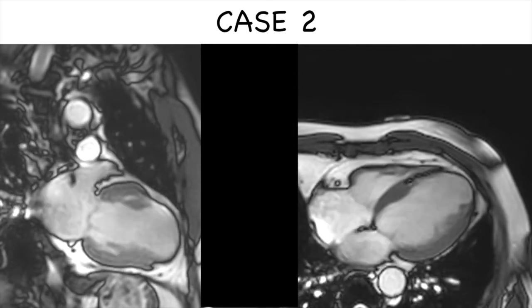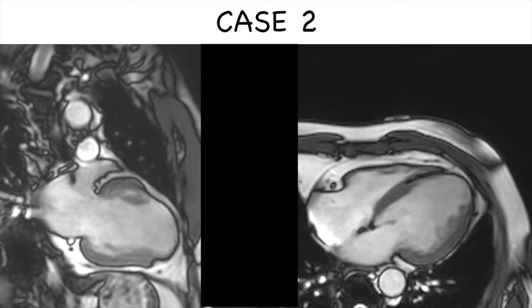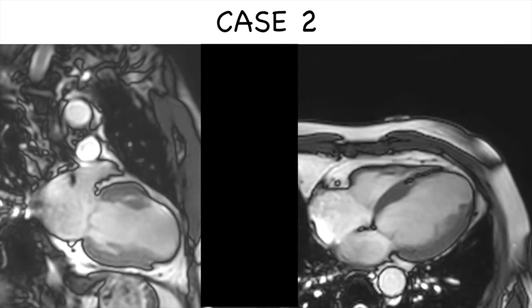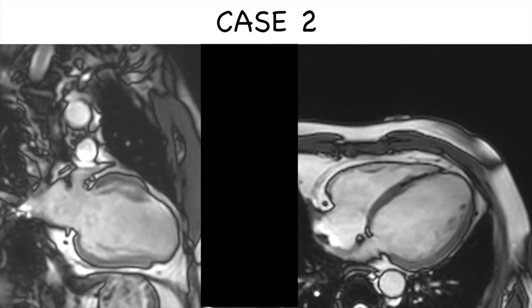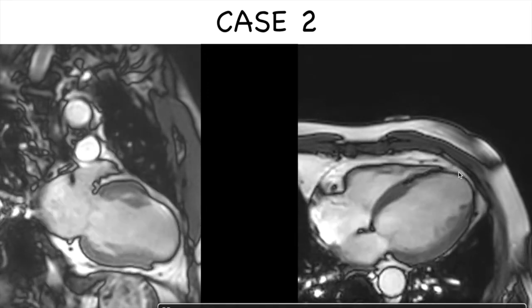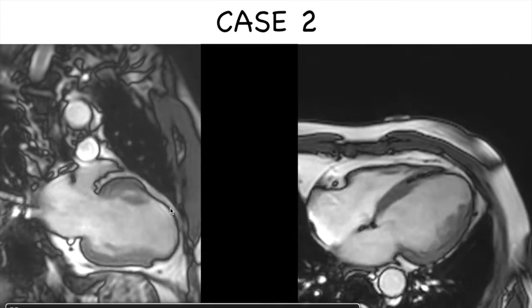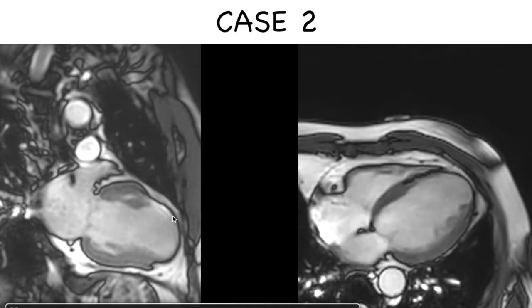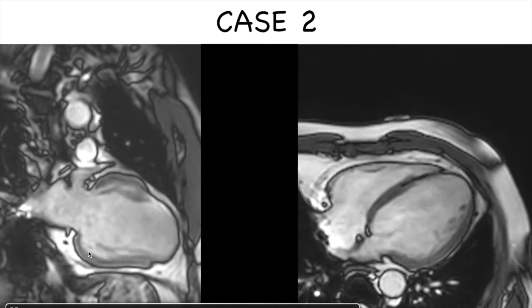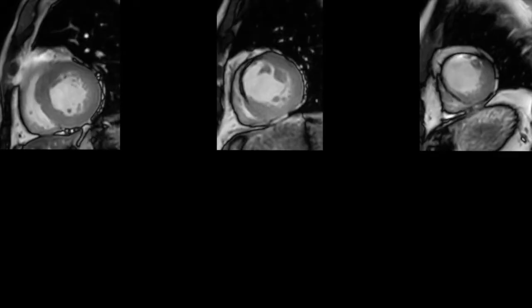When we look at the right ventricle, it is functioning well. There is very minimal mitral regurgitation. Now, on the 2-chamber view and in the 4-chamber view, what is obvious is that the apex is akinetic. It's not at all moving, it's thinned out. The apical anterior segment is also thinned and akinetic. However, the inferior segments seem to be working very well.